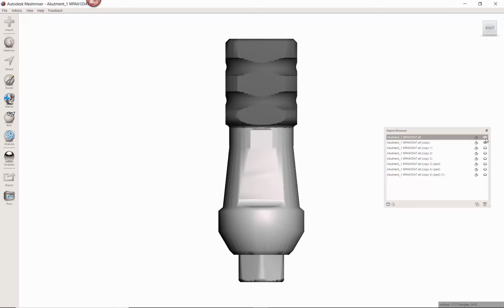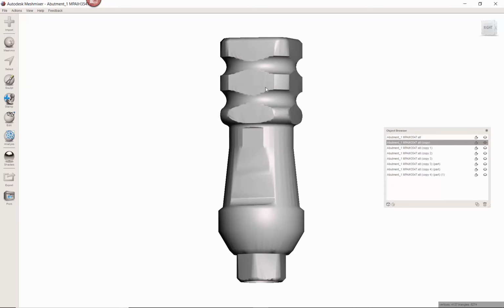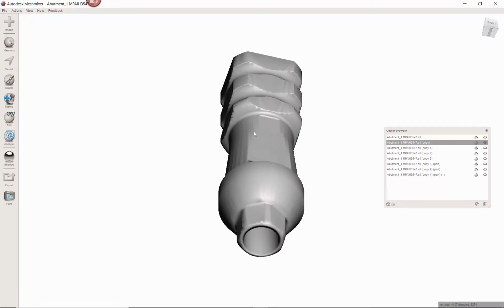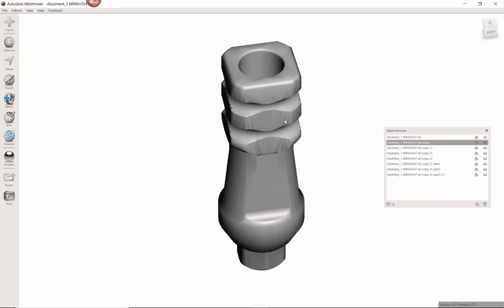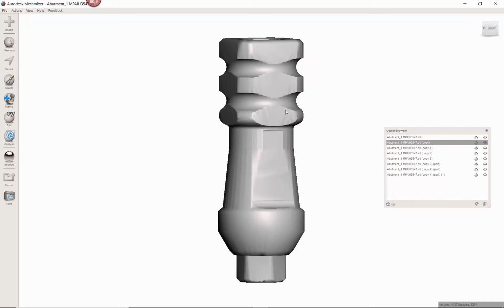This is what's called, the new term I just recently read was a three-way abutment. The idea is it's an impression post, it's a preppable abutment, and a temporary abutment. I don't know. There's three different things. But anyway, oh yeah, carrier. Implant carrier. You can drive it in the implant. You can use it as an abutment, or you can also use it as an impression post.